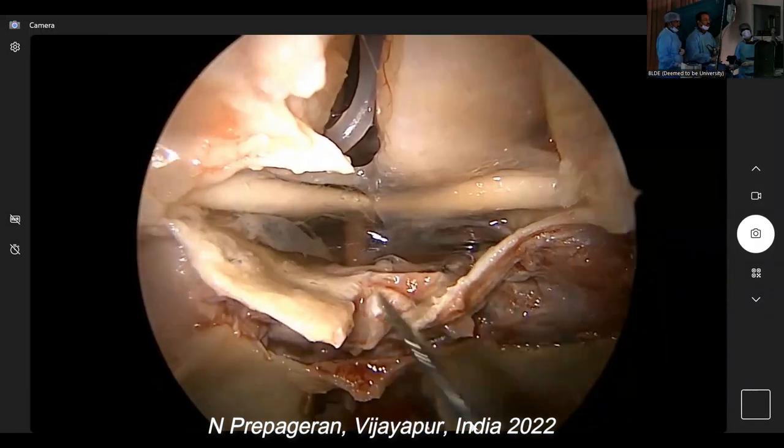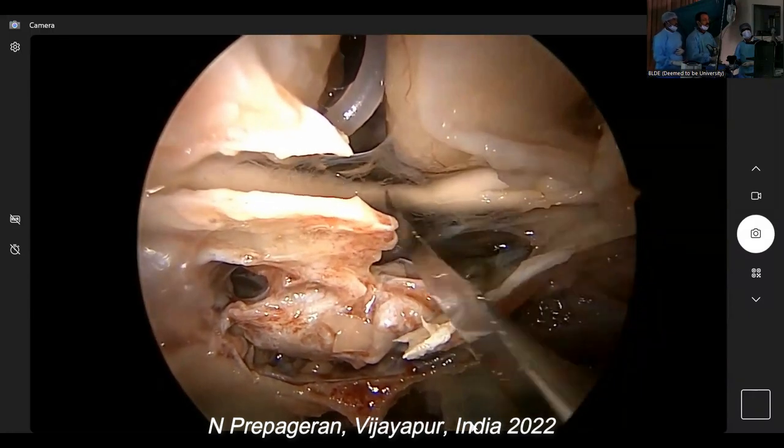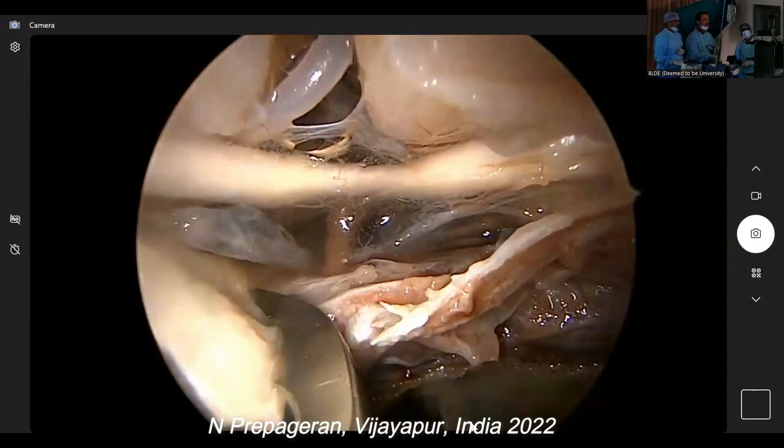Pituitary stalk. Can you see? Okay. Beautiful. Pituitary stalk at the back.